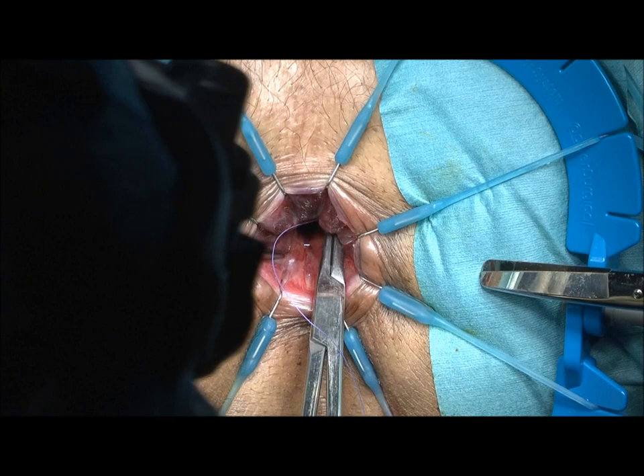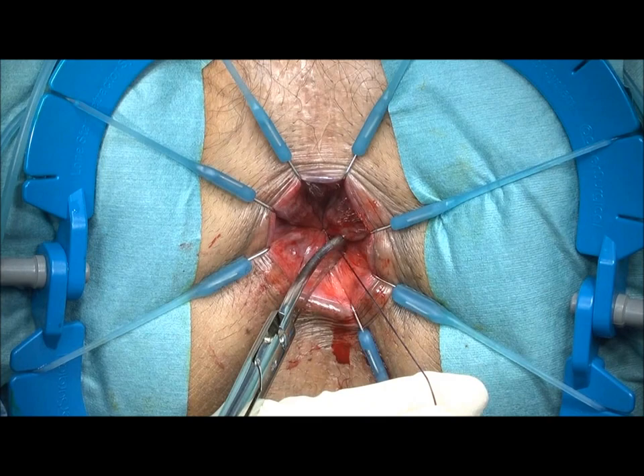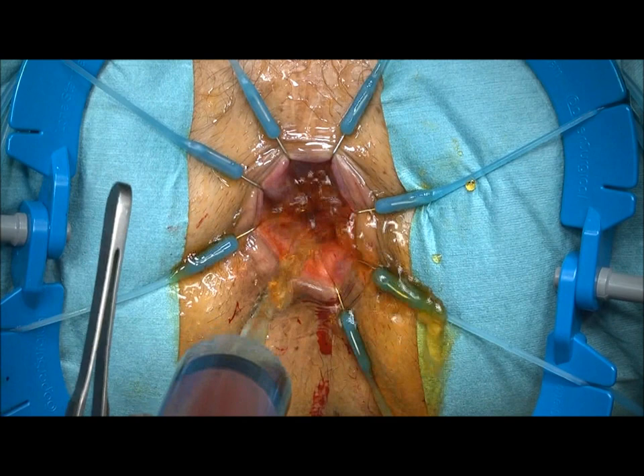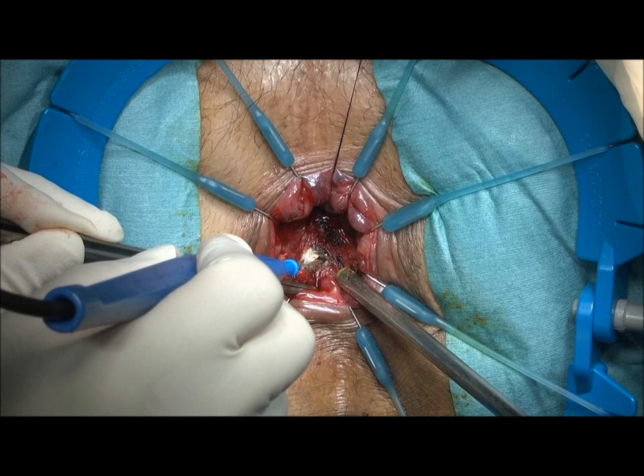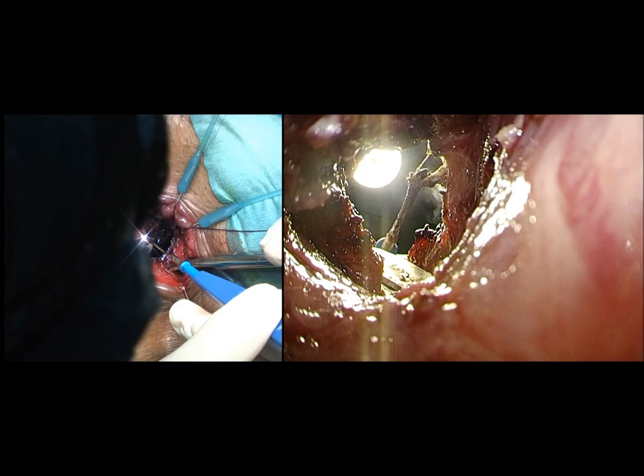The procedure moves to the anal approach. Rectal lumen is closed by purse string sutures. Mucosa and internal sphincter muscle are incised just above the dentate line. You can easily get into the intersphincteric plane, which was already dissected from a laparoscopic approach.